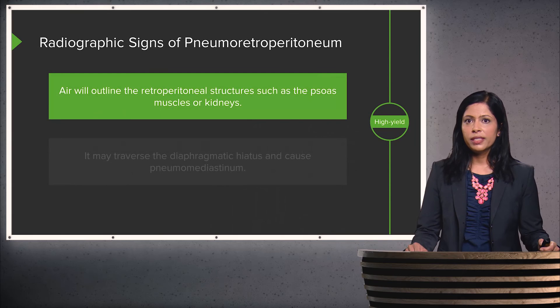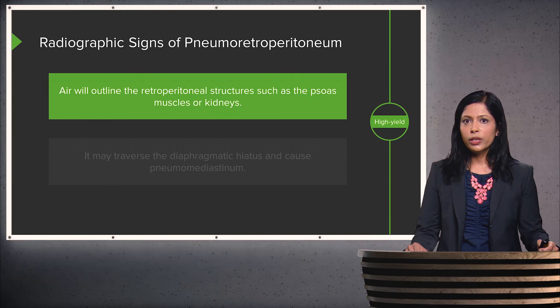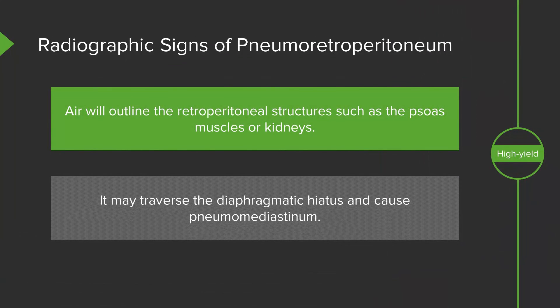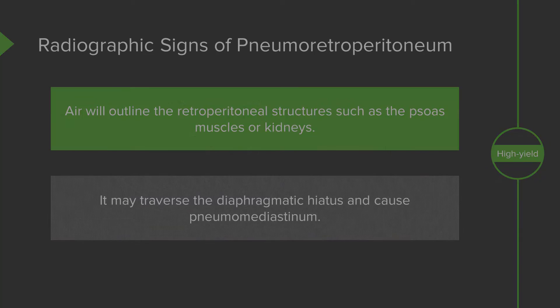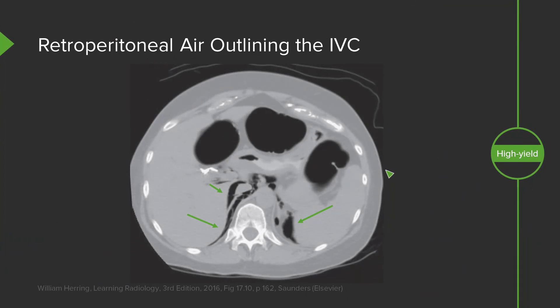Radiographic signs of pneumoretroperitoneum — free air within the retroperitoneal space — include air outlining retroperitoneal structures such as the psoas muscles or kidneys, and it may traverse the diaphragmatic hiatus into the chest causing pneumomediastinum. This example shows retroperitoneal air outlining the IVC and a portion of the aorta. You can see free air surrounding the IVC and retroperitoneally surrounding the aorta, as well as in the left and right upper abdomen.